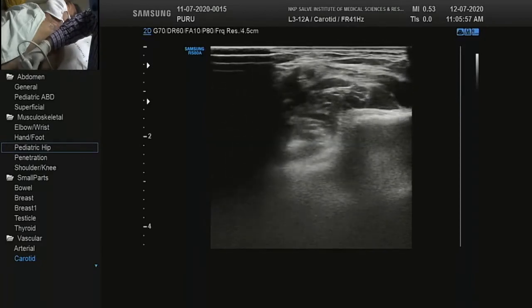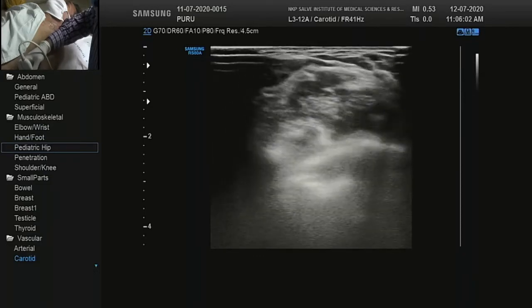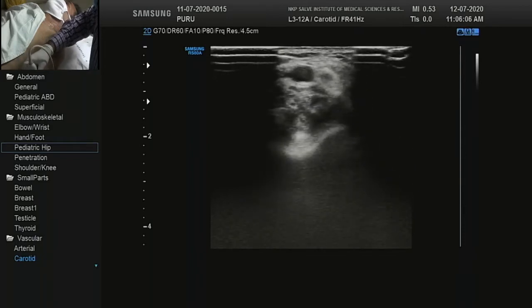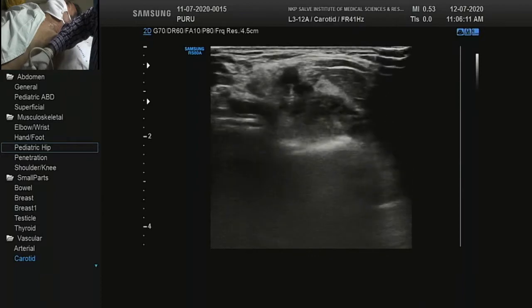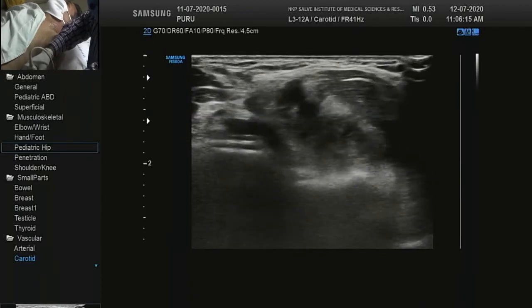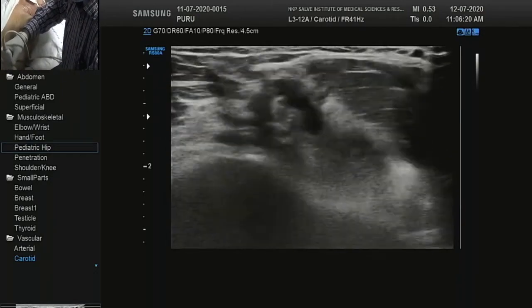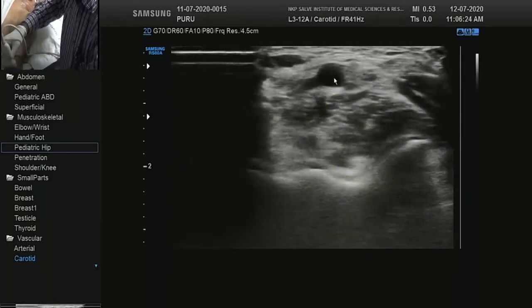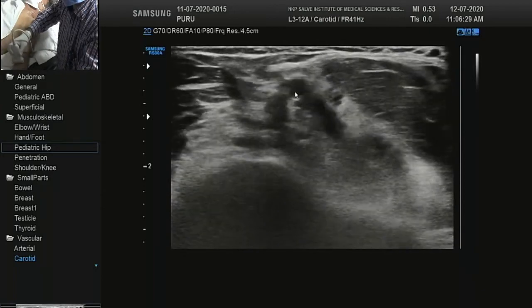So this is the brachial artery. I have almost reached the elbow joint, and now it will turn anteriorly and medially, it will come into the cubital fossa. Here you can see that the brachial artery has bifurcated. I think everybody can appreciate that bifurcation. I will just keep the pointer there. This is brachial artery, this is brachial artery, and this is bifurcated.